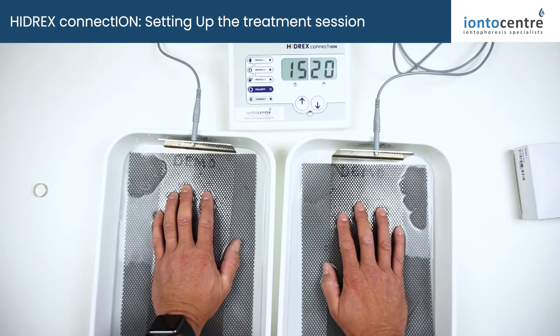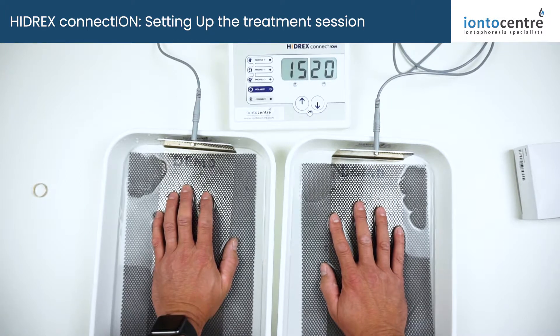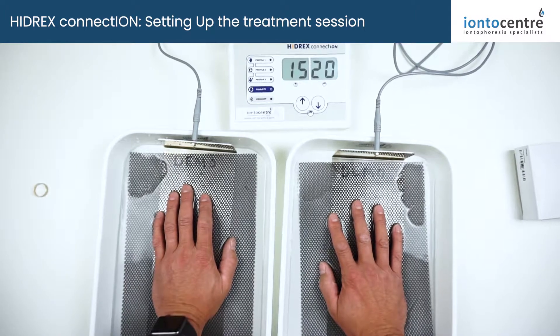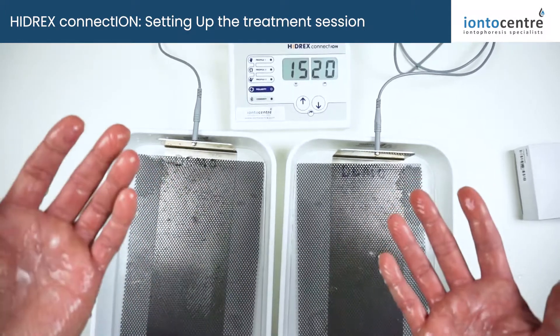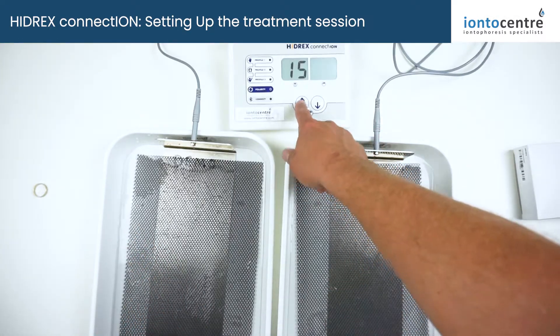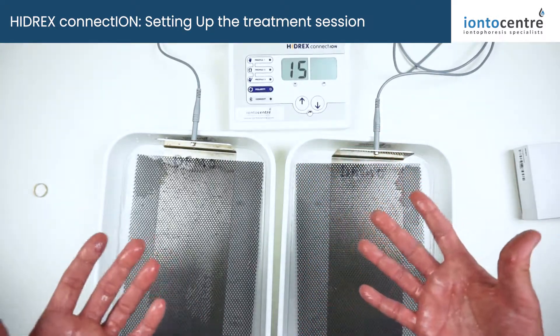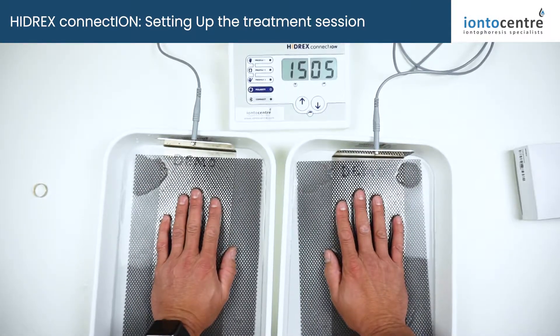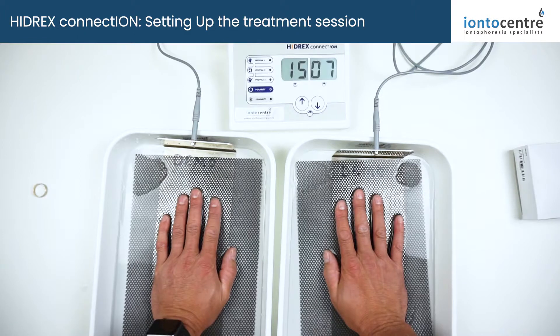You want to operate at the maximum comfortable level for you. One of the great features of these Hydrex machines — which you won't find in other machines — is the immersion monitoring system. If you want to make an adjustment, you just take your hands out of the water: no static shocks, no discomfort, it automatically pauses the treatment. You can increase to the power you want, come up to the maximum comfortable level, then re-enter the water baths and the immersion monitoring system takes over and starts powering back up.